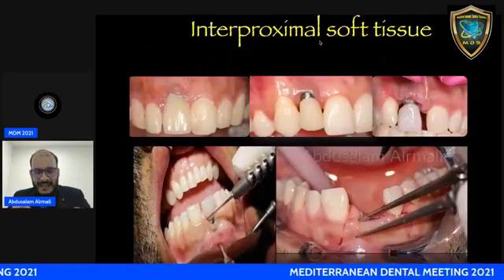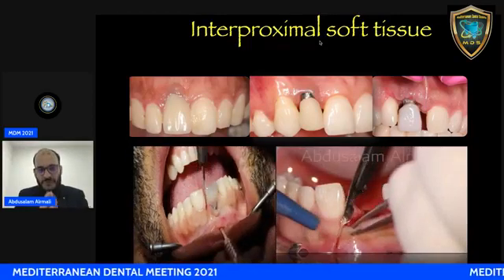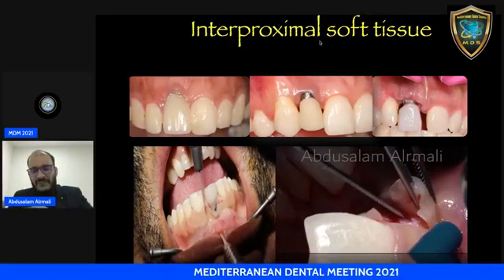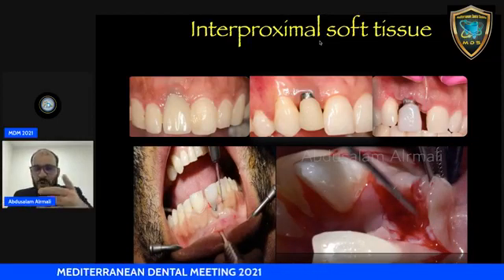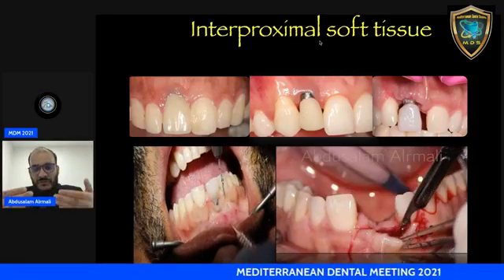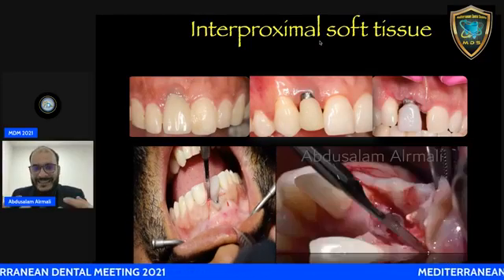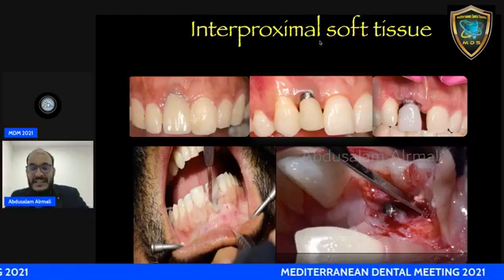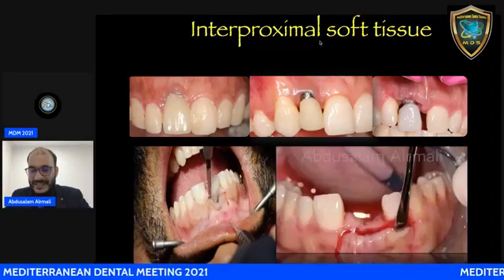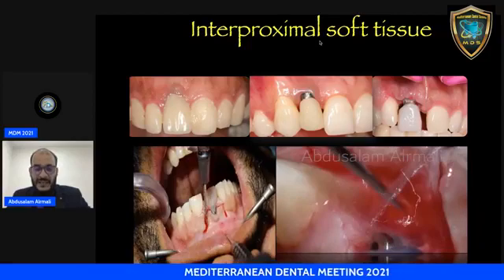So the other point is, as I said, the interproximal soft tissue integrity, because in some cases you can do soft tissue graft in the presence of the crown, as we can see on the left side. While in other cases, when we have a problem in the interproximal soft tissue, either resorption or recession, it's better to remove the crown, remove the abutment, place the cover screw, and let the soft tissue heal. You have to wait a minimum of 2 months for the soft tissue to mature and heal, and deal with that site as an edentulous site, and start from zero by splitting the soft tissue, elevating the papilla, mesial and distal, split thickness, surgical, anatomical, and try to coronally advance this flap and treat this complication, as we can see in the cases later.